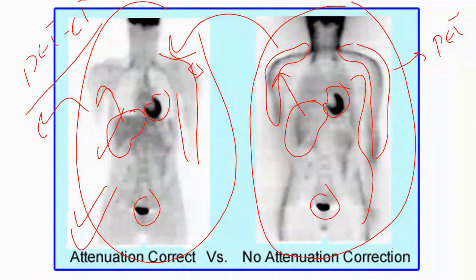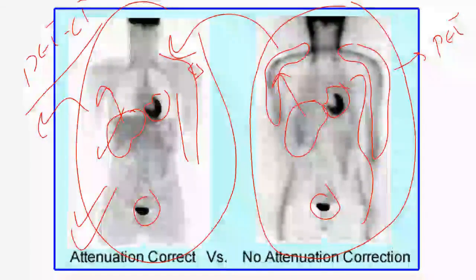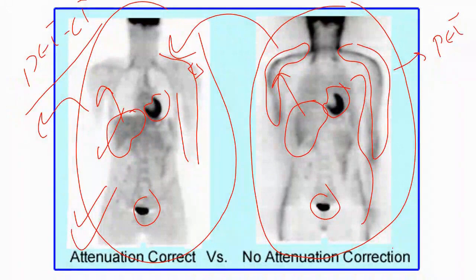Yes. Exactly. Are the changes weak or strong? Weak. Okay. Will the count that reaches the detector be a lot or a little? A lot. He will see it illuminated. That's why I didn't see it illuminated. Is that clear, doctor? Clear. So when he takes it in the CT, did it arrive or did it not?